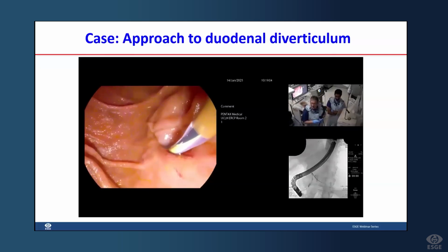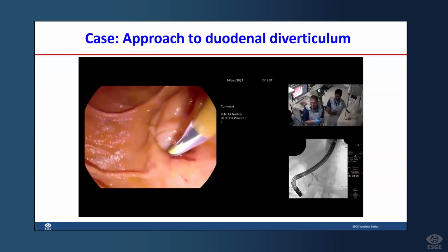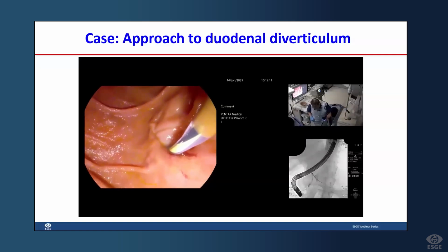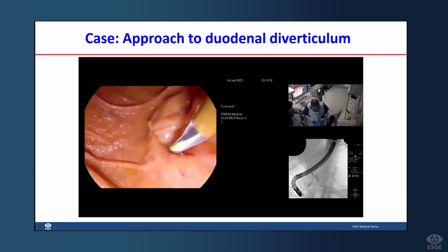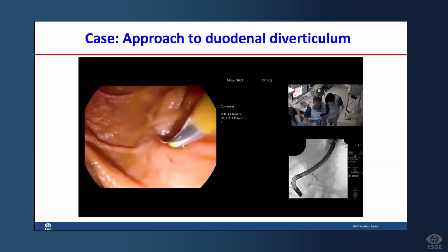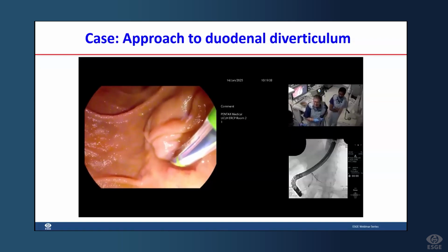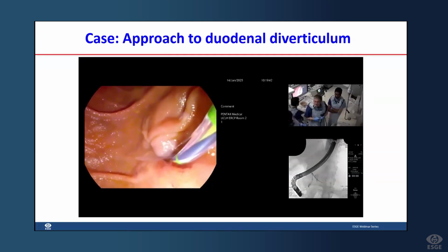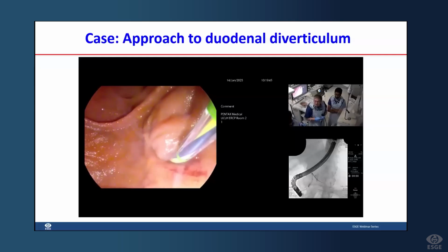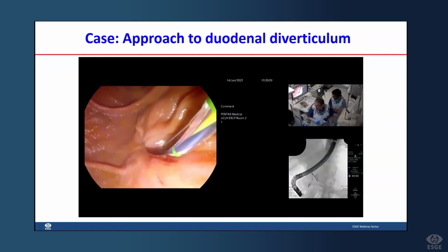I've had difficulty getting into the bile duct. I want to bring the ampulla out of that diverticulum. So what I'm actually going to do is a very small little mucosotomy here. This isn't a transpancreatic sphincterotomy. That's something we can talk about. So I need a little bit of bend, please. Okay, that's fine. Okay, that'll do me there. 5 centimeter 5 French, unflanged.